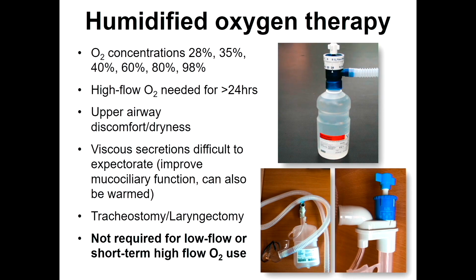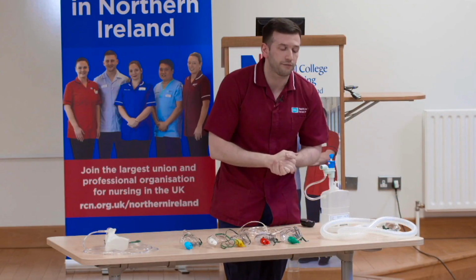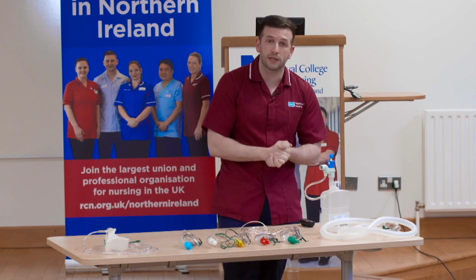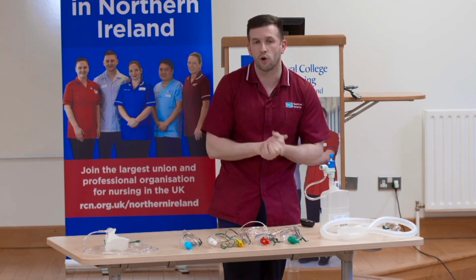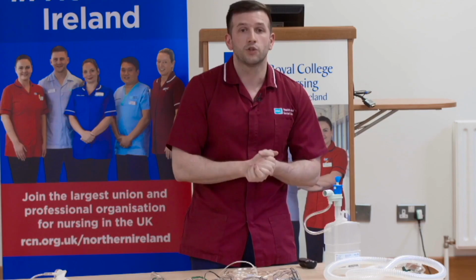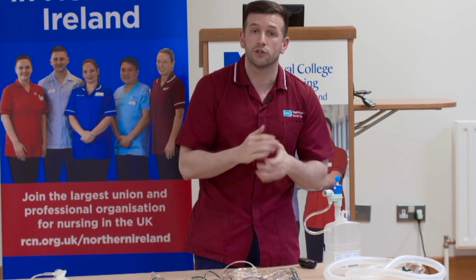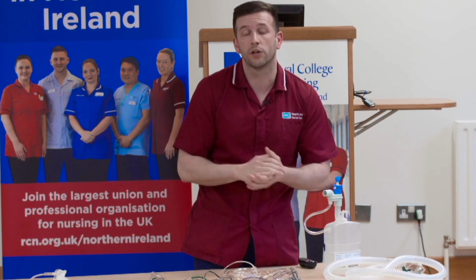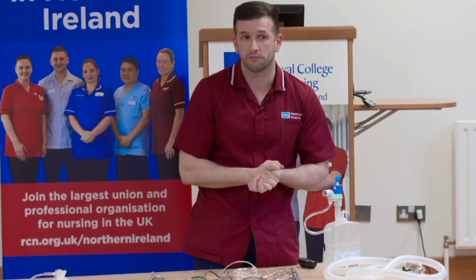In relation to what's going on at the moment in regard to nursing individuals with a viral illness such as COVID-19, at this moment in time, there's no strict guidance against the use of humidified oxygen therapy, but understandably, using a water-based circuit can increase the risk of water droplet transmission. So my advice to you, if you're considering humidified oxygen therapy, is that you consult your local policy or protocol, and discuss with your infection control or your local respiratory nurse specialist.